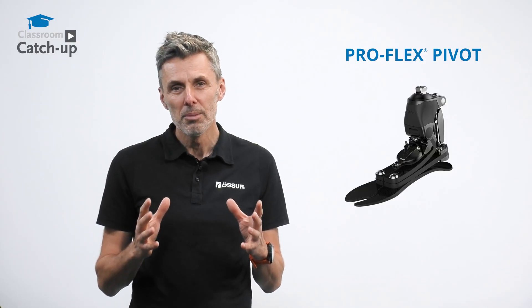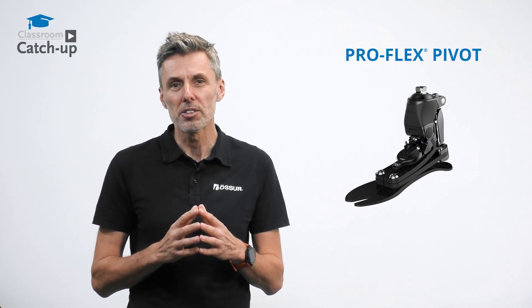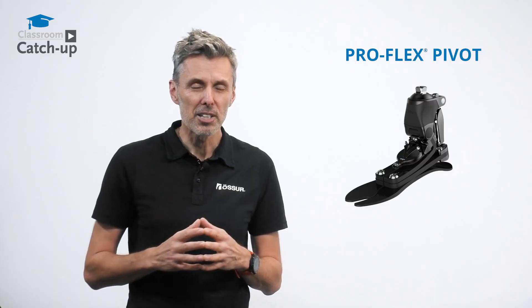The ProFlex Pivot, using its tri-bladed design, manages not only to have an increased range of motion but also unprecedented levels of ankle power generation during starts. Let's take a closer look.